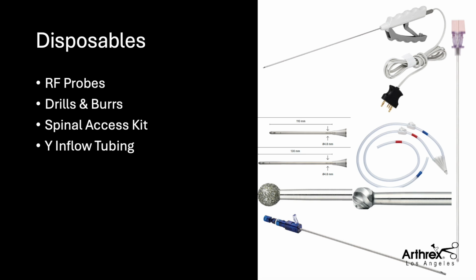We have some specific for Arthrex that will work in arthroscopy that are available to you. The NSK ones are separate, and also have a console that's completely separate, so you need to verify what drill they're going to use. But typically, again, you're going to bring 2 or 3 of these to each case, just because if one was to drop, we want to make sure we have another one, because again, all of these accounts do not have this setup.